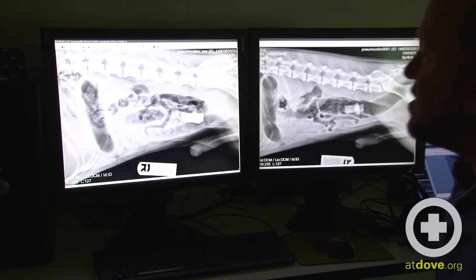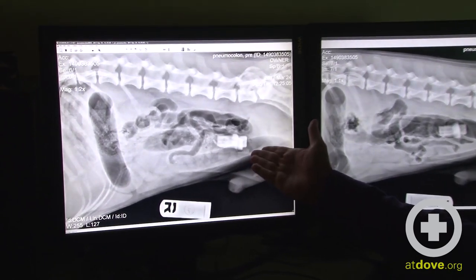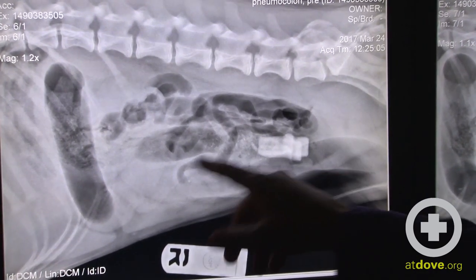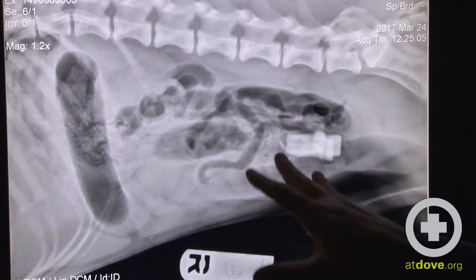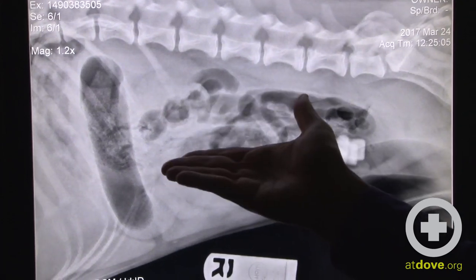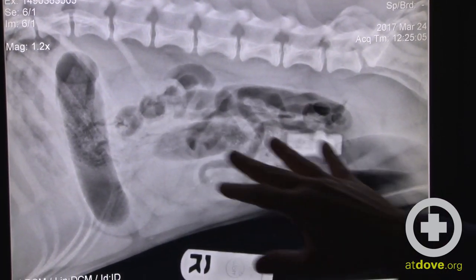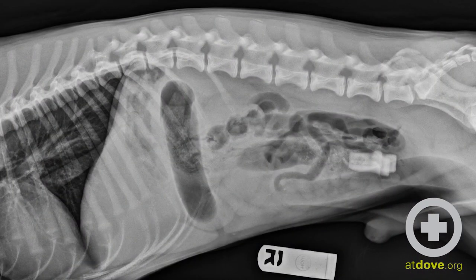This initial radiograph of the abdomen shows a radiopaque structure that doesn't belong there in the caudal abdomen. We also have several distended segments of the GI tract. We can see the stomach, what may be colon or small intestine, and then several other distended small intestinal segments. The question was: where is this structure anatomically?